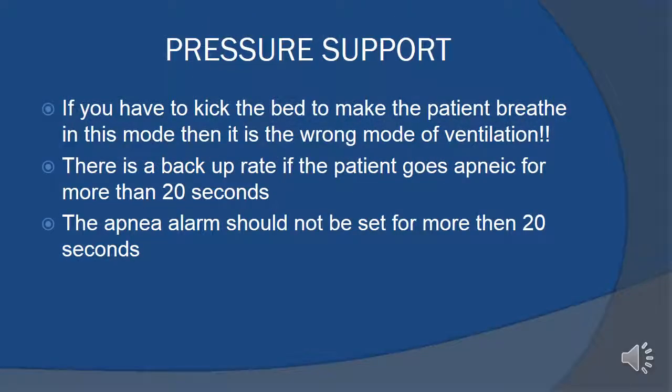So some important things you need to know about pressure support. Once again, this is a spontaneous mode of ventilation. There is no set respiratory rate. The patient drives all the ventilation on their own. For this reason, they really need to be fully awake in order to be in this mode.